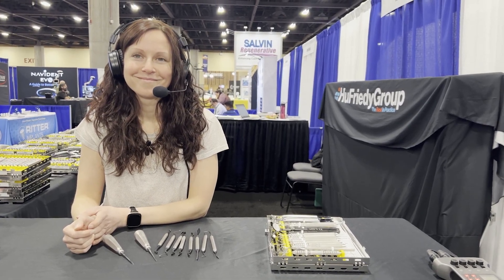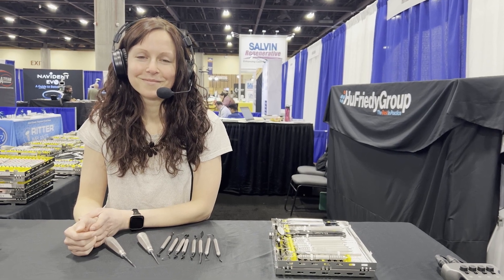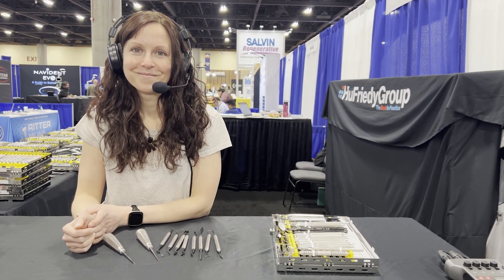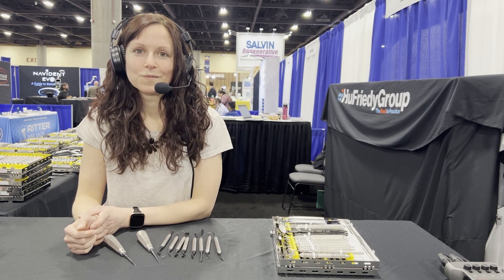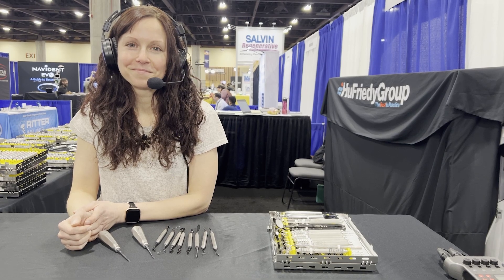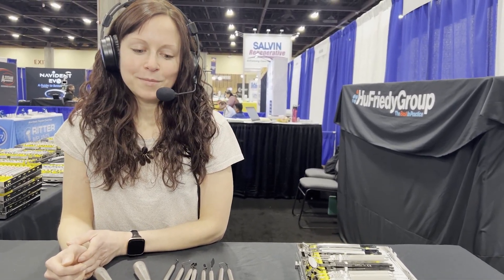We are at the 2023 Academy of Osseointegration meeting here in Phoenix, and I am at the Hu-Friedy booth with Jennifer. I really want to bring to your attention a new product line that they came out with in the last couple of years that I'm very fond of. But since I've got Jennifer here, we can show you a whole variety of some of their instruments. Jennifer, you've been with the company for a while? I've been there for 13 years. That's a good tenure.